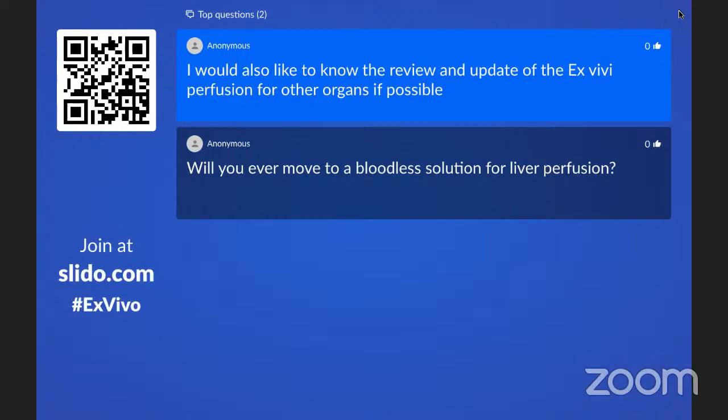There's no pancreas perfusion at this point. Dr. Reichman from Toronto, from UHN, is actually probably the world leader in this field, and he actually has an animal model studying pancreas perfusion in pigs, and he is now working out the biology of this. As I said, the tubing and the pump is not the problem. He tries to now investigate what the pancreas wants in order to be happy and healthy outside the body. This is like 5 years of research before you know that, and then you can do this. And there's nothing done in small bowel or other organs in this regard.